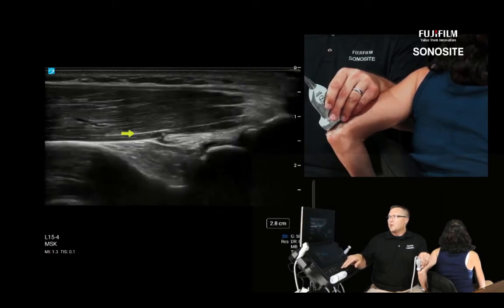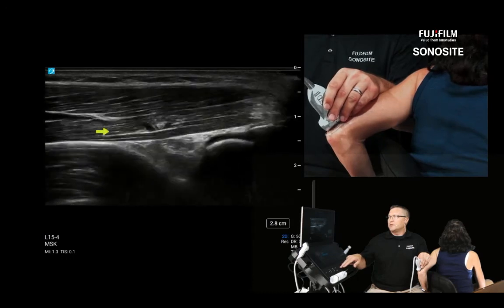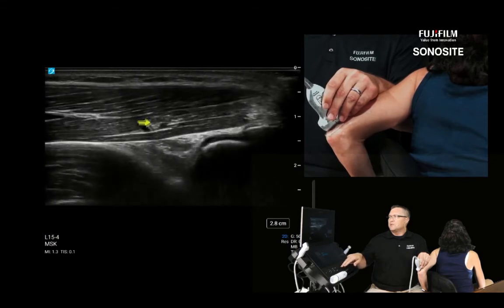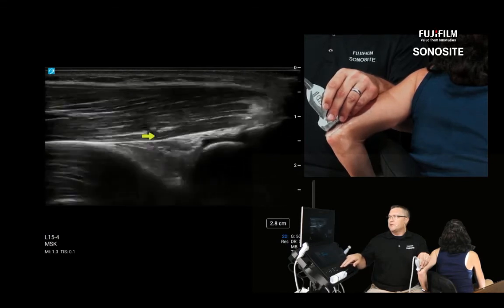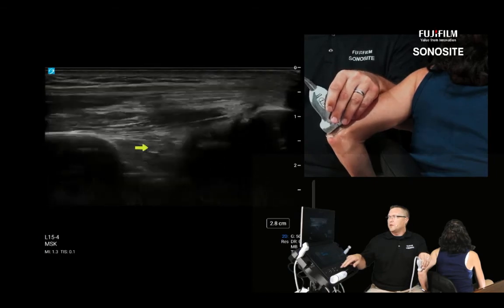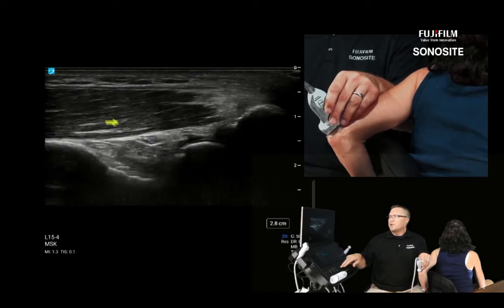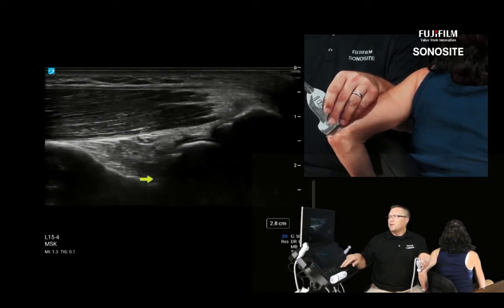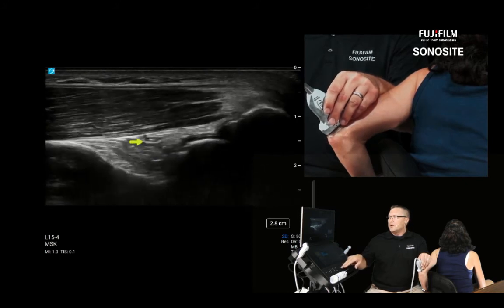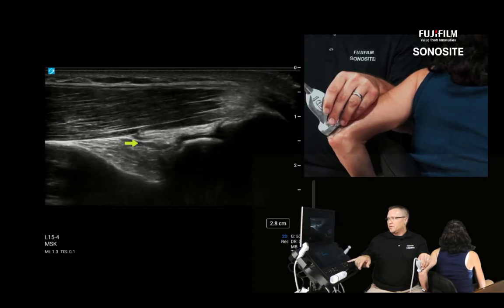With the resolution of this L15 transducer, we're really seeing nicely with very little to any artifact the very hypervascular nature of the posterior triceps right here as it starts to go through the fat pad. So if you are going to drive a needle through here, as I've seen many people do blind or on fluoro, and you're going to drive a needle straight under the fat pad and just jam it into the olecranon fossa, hoping to hit the joint, try to avoid these little bleeders here that could leak into the joint.